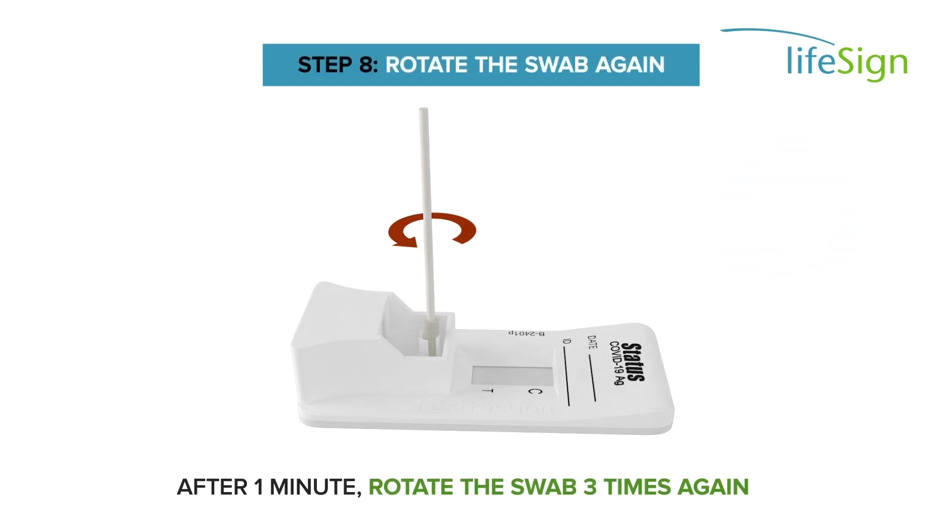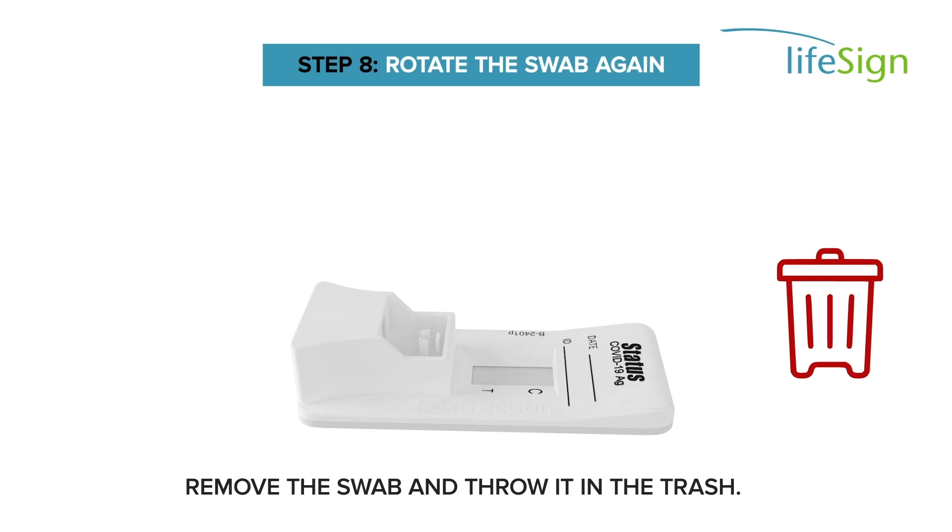After one minute, rotate the swab three times again. Remove the swab and throw it in the trash.